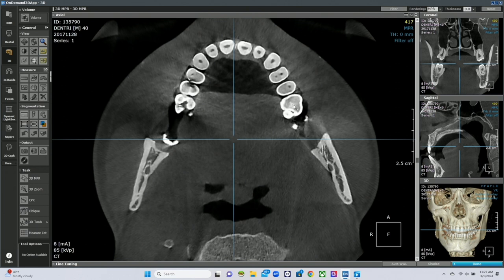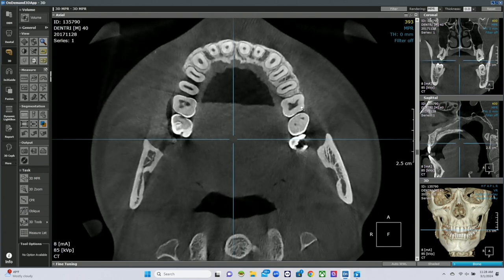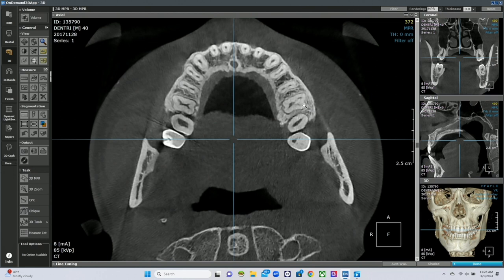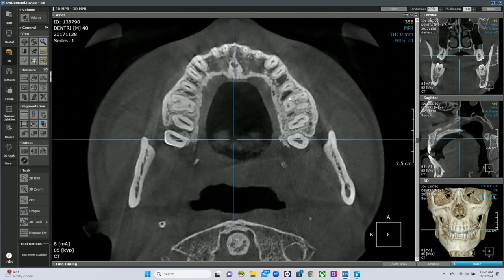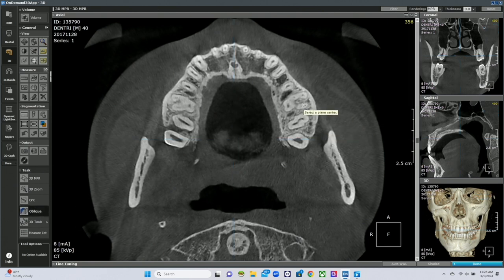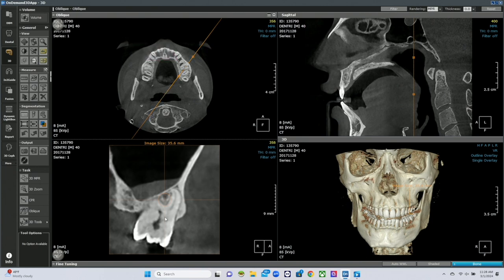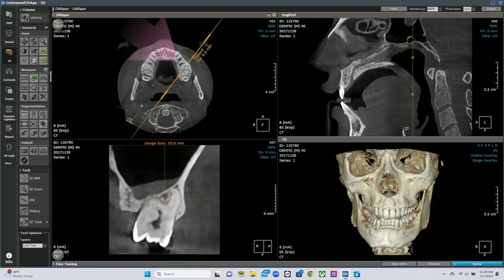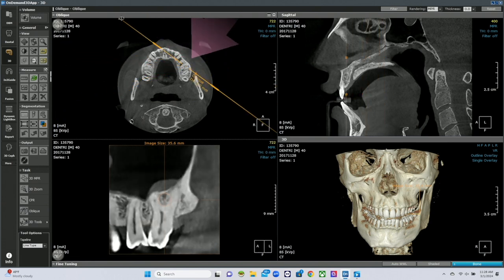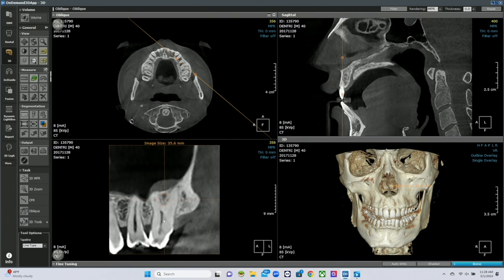Doing an endodontic analysis, we can go to this tooth, go through the axial view, keep scrolling down, and see as it breaks into buccal and lingual roots. In this case, we can actually see that we have an MB2 canal right here. As an endodontist, you need that information before you attack the tooth to make sure you get all those canals. We can go 360 degrees around the tooth and found that this root had a curvature. We can make a measurement to know where that curvature happens — so during the endodontic procedure, we know where to change to a flexible file. And we verify we have an MB2 and a distal buccal root as well.